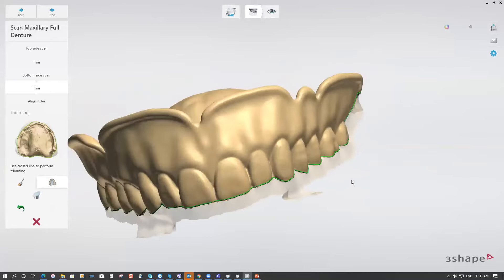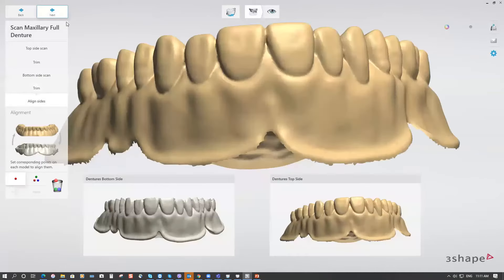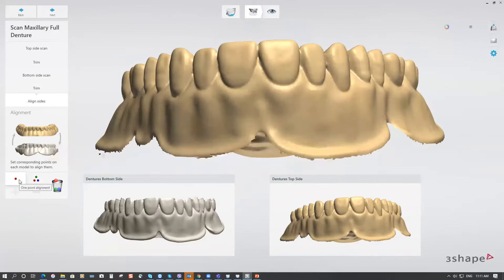After that, we are ready to align both scans — top and bottom. We have two options: one-point alignment and three-point alignment. Let's use the one-point alignment and see how it works.